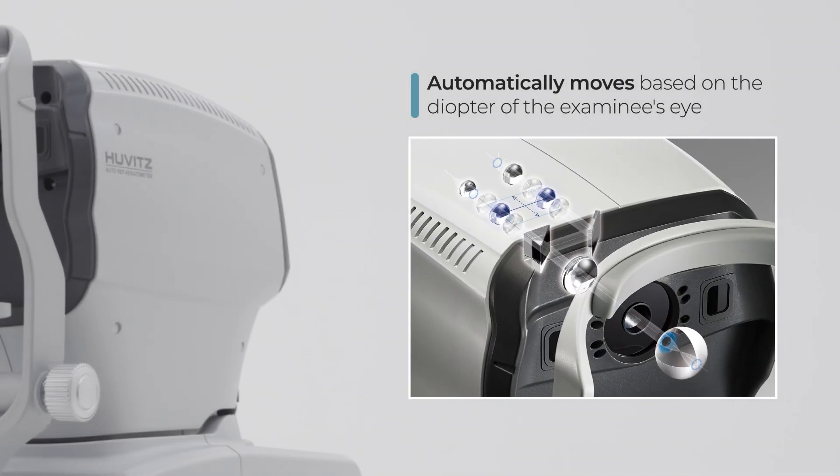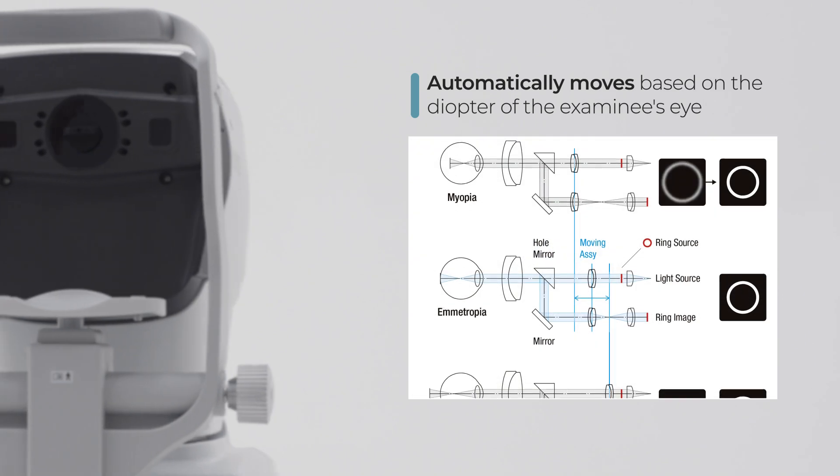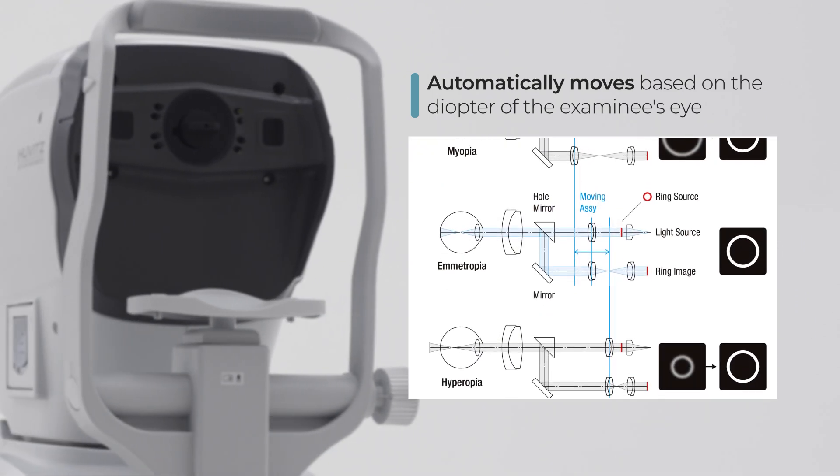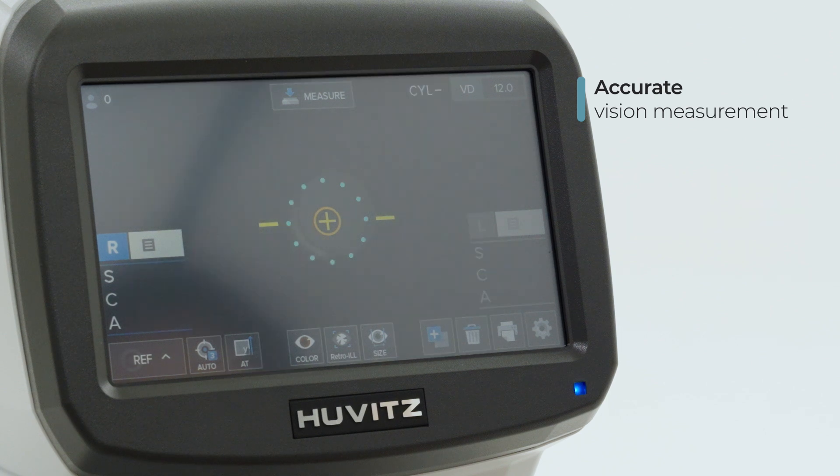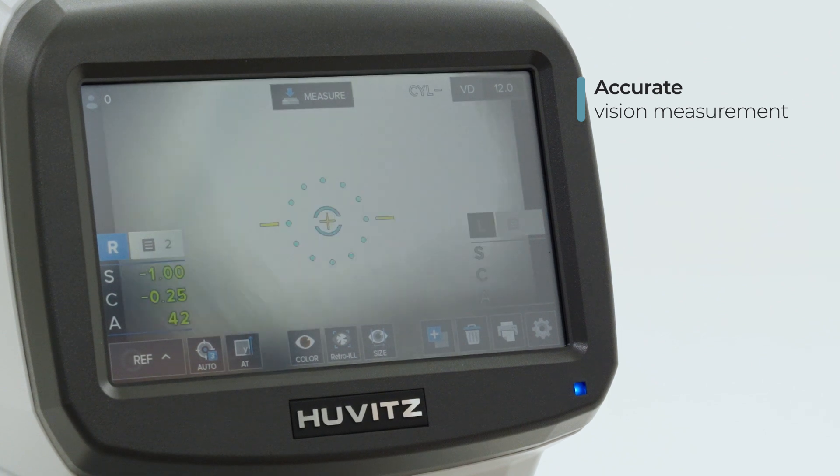Considering the refractive error of the patient, the measurement ring is projected on the retina and is adjusted automatically by smart assembly moving to secure a stable signal.